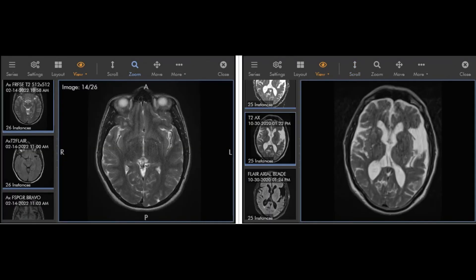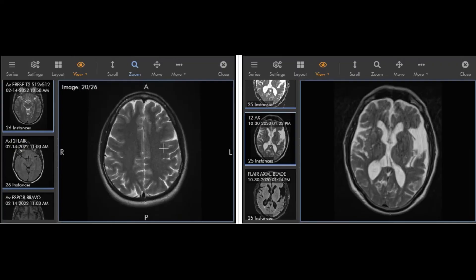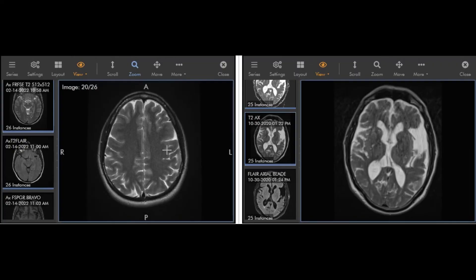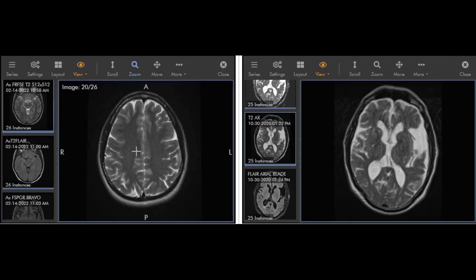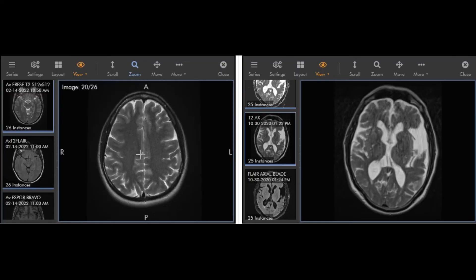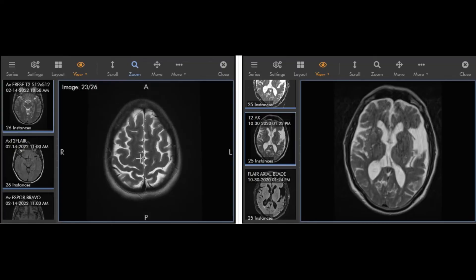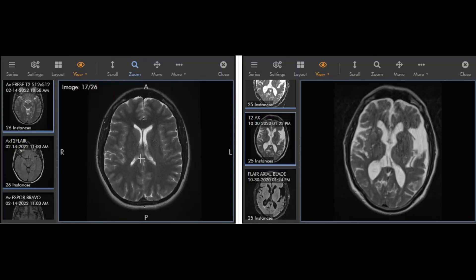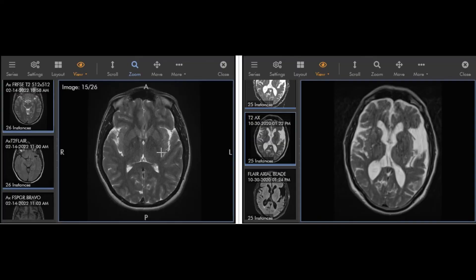Okay, so now what I want to do is contrast a normal brain with a brain that has some more severe atrophy. So as I said before, radiologists typically will say whether a brain has no atrophy, mild, moderate, severe, and sometimes we'll say whether one lobe is more atrophied than another. They'll say something like frontal predominant or frontoparietal, meaning both the frontal and parietal lobes are predominantly the ones affected. But for the most part, our brains will age in a somewhat general way.